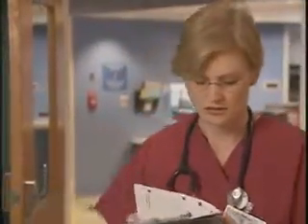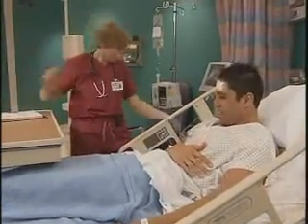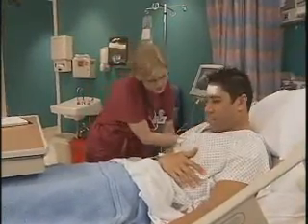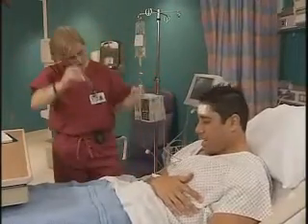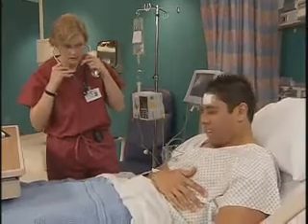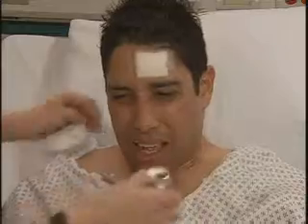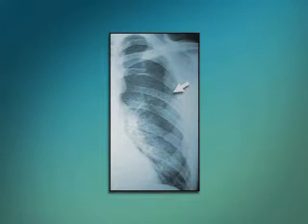Today you're assigned to care for a 24-year-old patient who was recently admitted with a chest wall injury caused by a car accident. Are you having trouble breathing, sir? I can't breathe. Okay. Is anything making it worse? During your initial assessment, he reports shortness of breath and a sharp pain on the left side of his chest on inspiration. A stat chest X-ray confirms a left-sided pneumothorax. Now you must act quickly and help insert a chest tube to correct the problem and prevent further respiratory compromise.